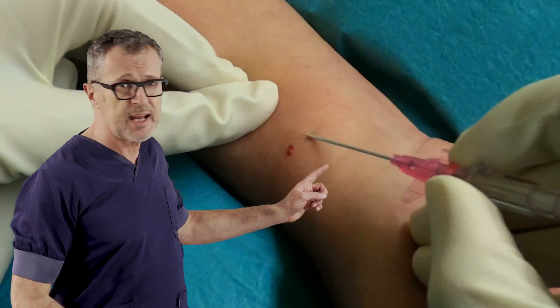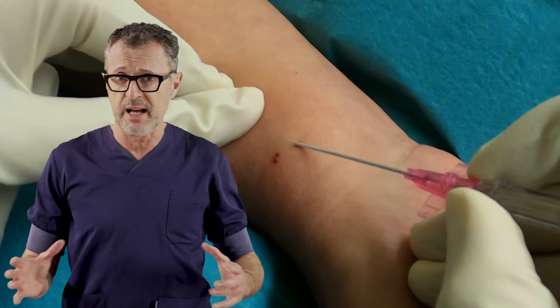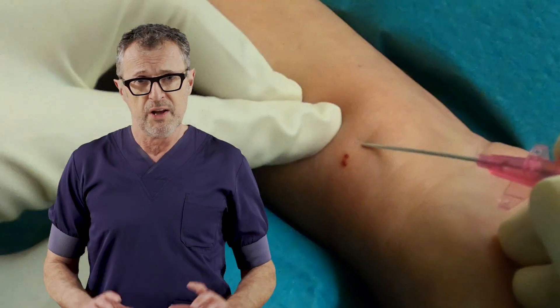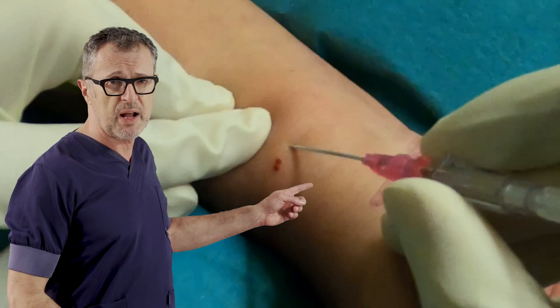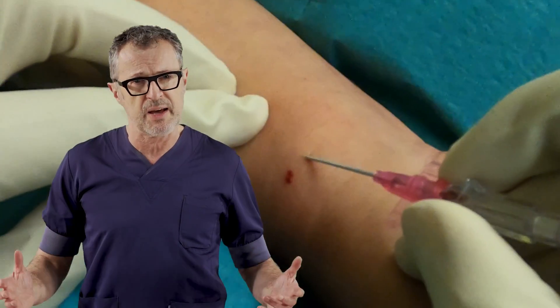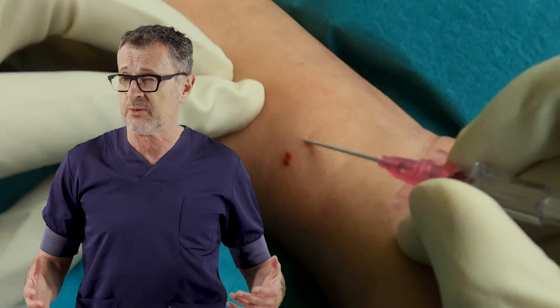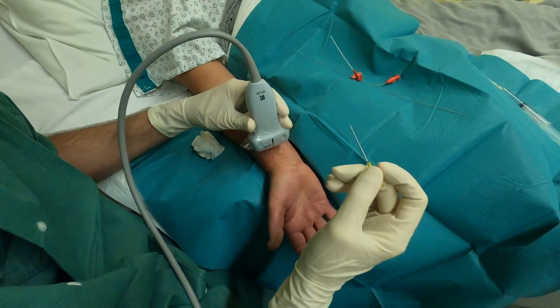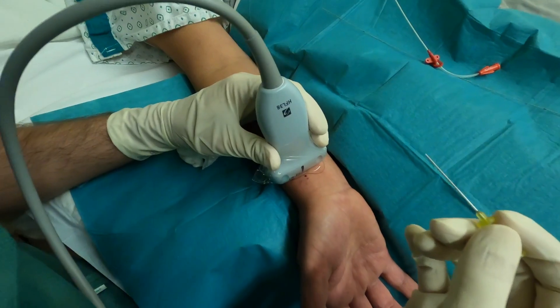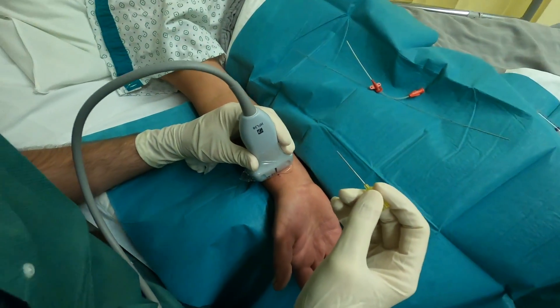As you remember from the last video, several attempts at anatomy-based radial line cannulation failed. We were able to obtain arterial blood flow but we were not able to insert the catheter and get an adequate arterial waveform. So we're switching now to ultrasound — let's see what we see.